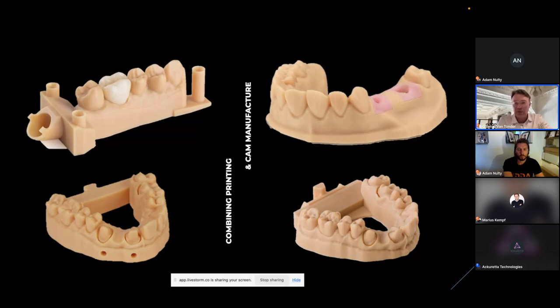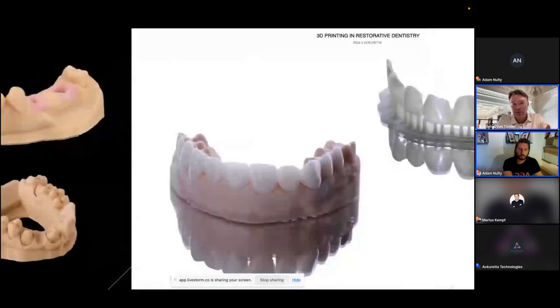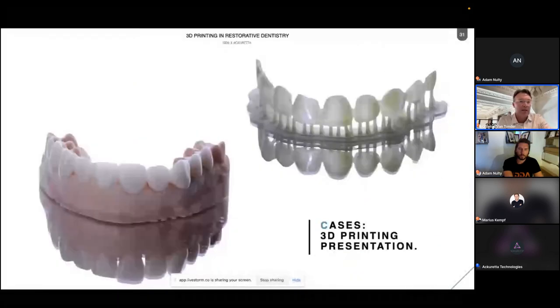And you know that, okay, this is now the step that we are using, or you can use it as a diagnostic workflow. So you have a patient with a really difficult occlusion. You want to make sure that they can function with what you've made for them and then take it further from there, modify it, and then copy and paste that later on if you want to go to full ceramics.